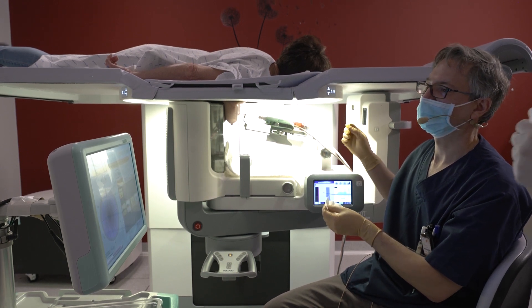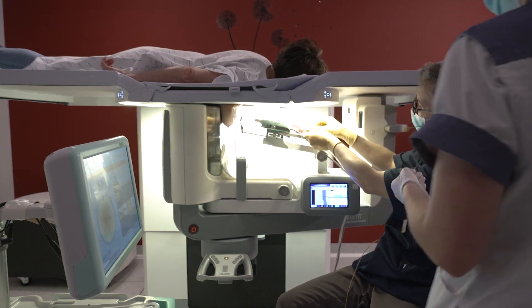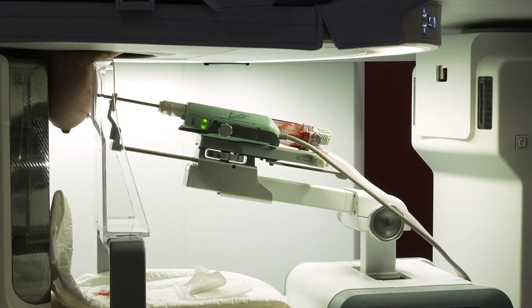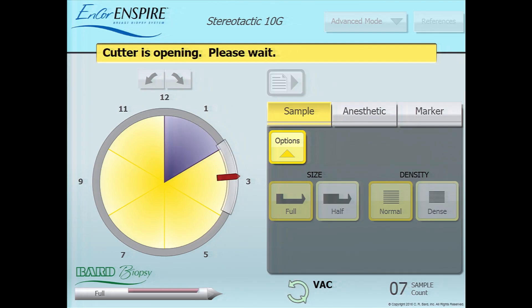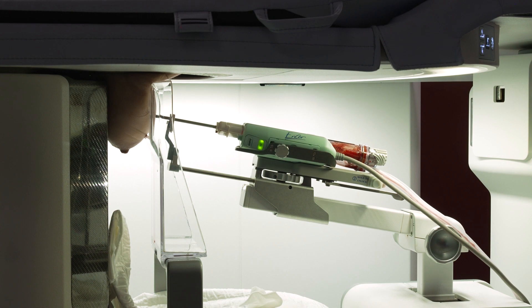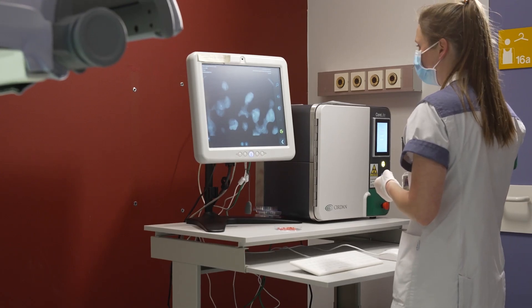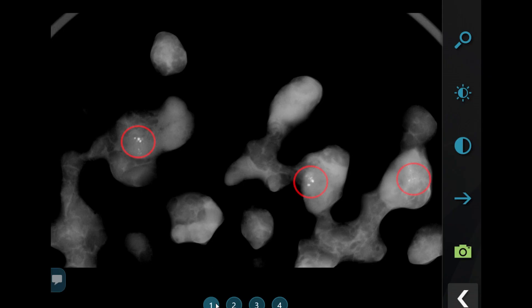After taking the first round of sampling, the collection chamber is removed from the needle to collect the samples. Then a second round of 6 samples is taken. In case of local bleeding, we can aspirate the blood with the Encore needle. During the second round of samples, an X-ray image of the first 6 samples is acquired. The CoreLite system will display the image right after the exposure. This X-ray confirms the presence of several microcalcifications in the resected cores. At this point, the biopsy is already successful.